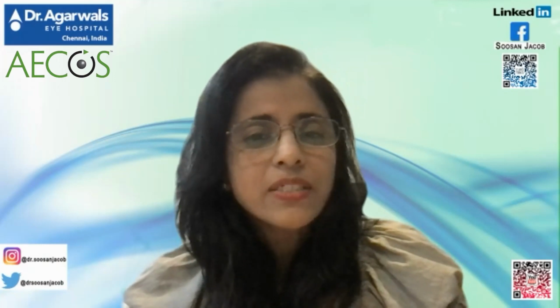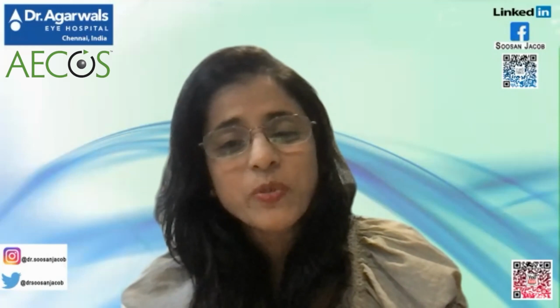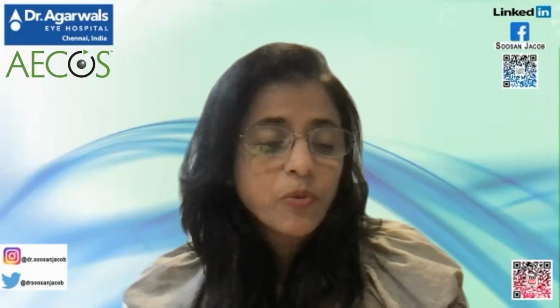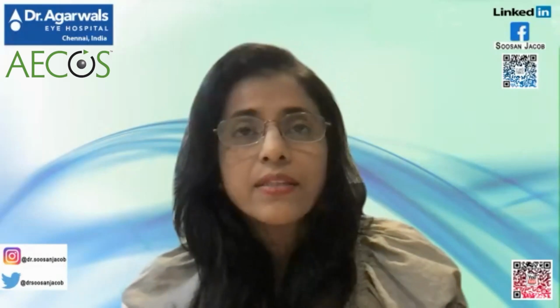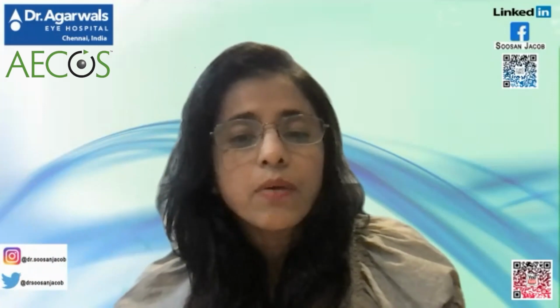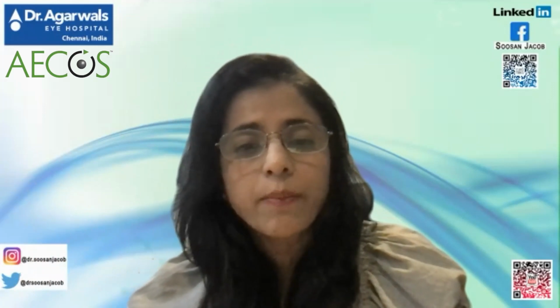I'm a little bit hesitant on topo-guided PRK for doing subtractive procedures in keratoconus, but I know the great surgeons and people whom I respect so much who are doing this, and they're so happy with their results. And I think that definitely is one of the ways to go forward. You could combine it with phakic IOLs, you could combine it with topo-guided PRK, you could combine it with maybe a refractive lens exchange in some cases. So there's so many things that you can actually combine it with.